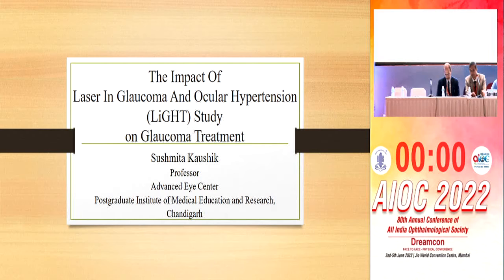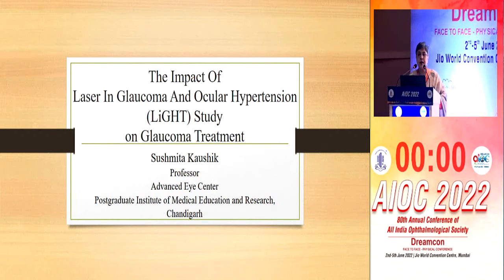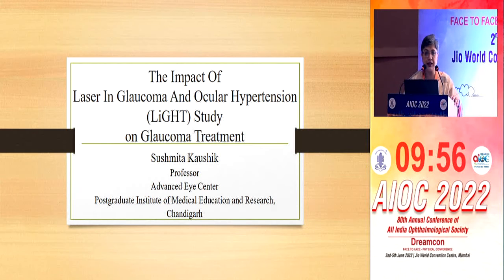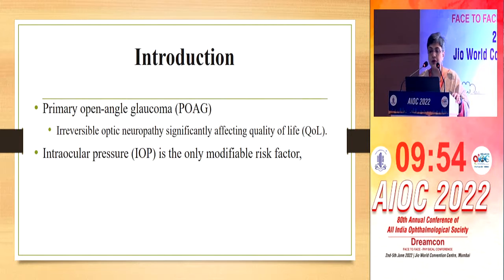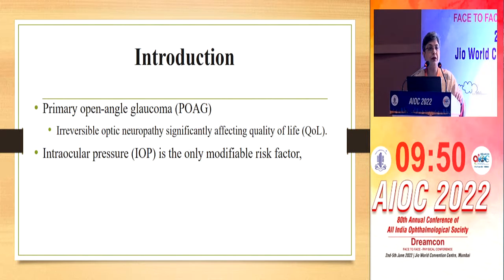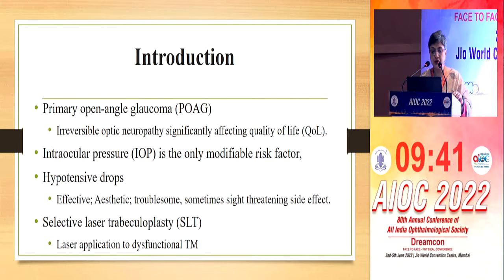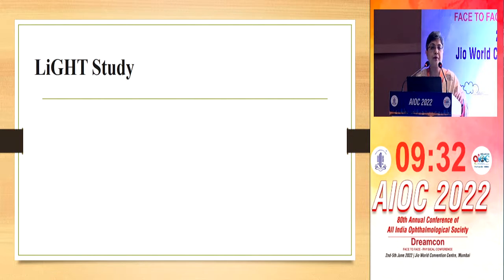Thank you for the opportunity to bring this. I'll be talking about an important study, the LiGHT study, published not so long ago. We know that primary open-angle glaucoma is irreversible, and intraocular pressure is the only modifiable risk factor. So we have hypotensive drugs to reduce the pressure, and we also have SLT, which has been around for a long time. It is laser application to the dysfunctional trabecular meshwork.